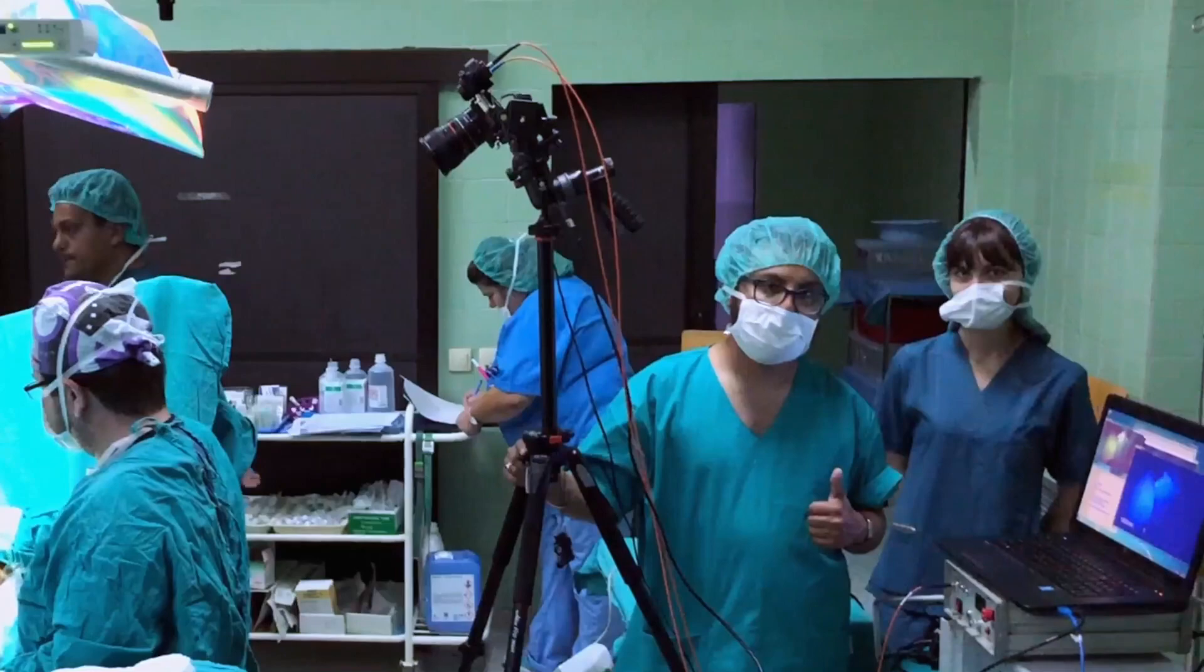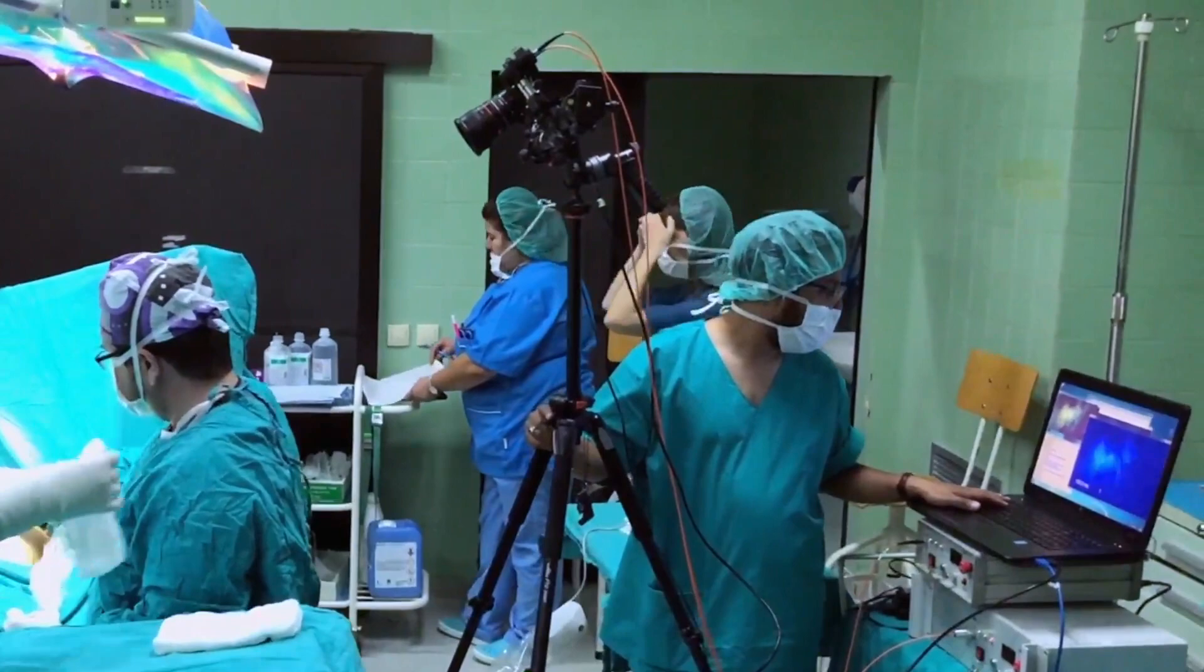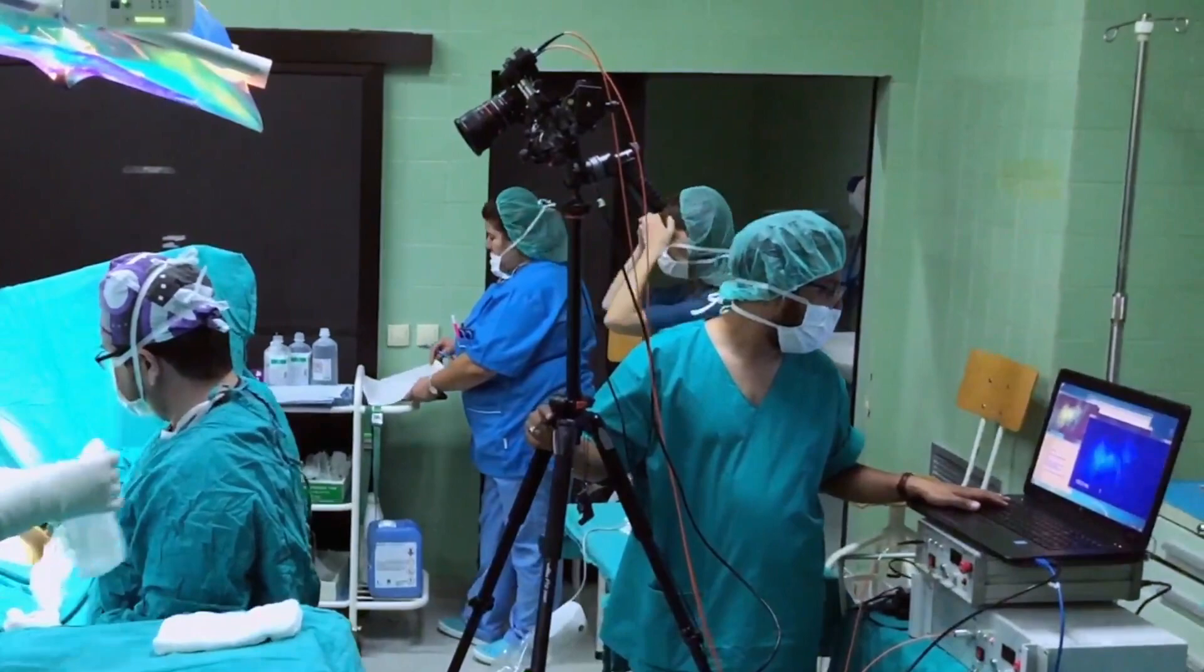These tasks, the detection of tumors and of sentinel lymph nodes, are key to curing cancer and preventing recurrence.